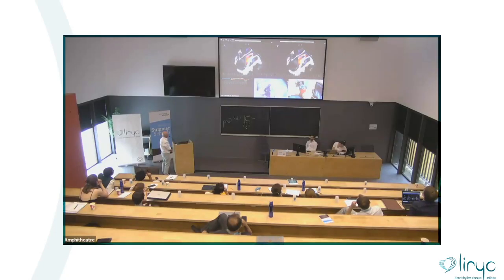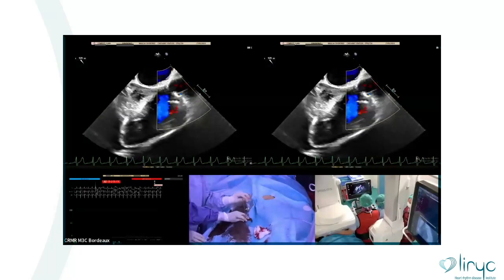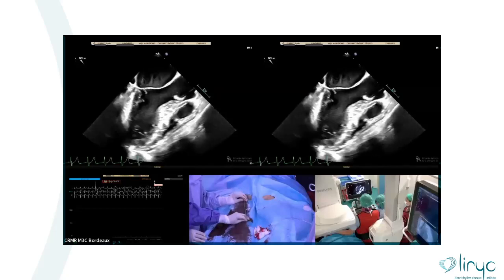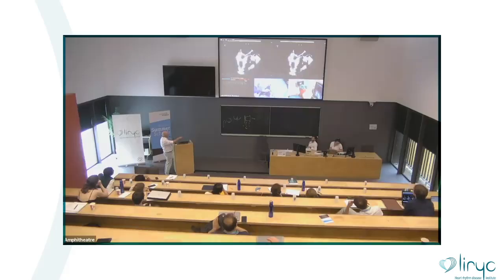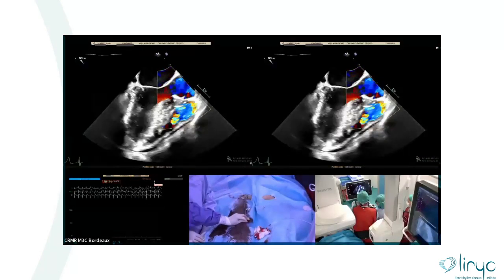Now we need to see whether this aortic regurgitation is due to the cable or the device. Advance the cable more to help the echo test. Yeah, that's in a good position, right? Advance the cable, you can shoot the good position, so echo can check again.